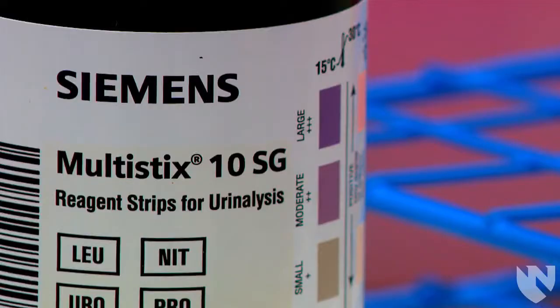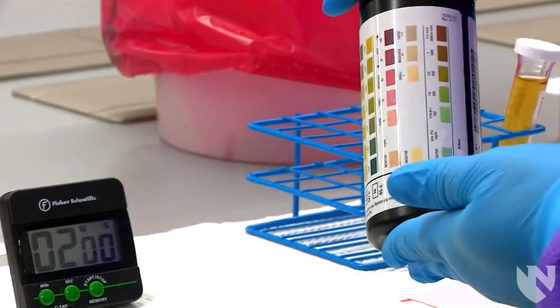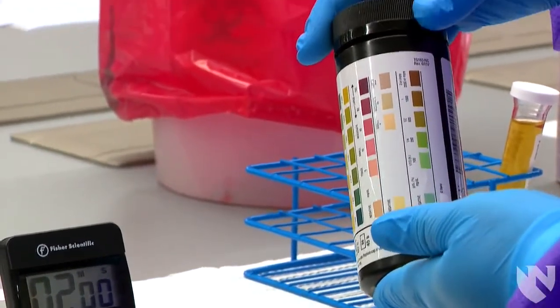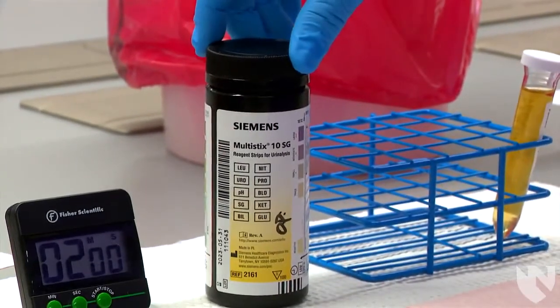In this video, we will be using the multi-stick 10SG reagent strips. The strips are contained in the reagent strip canister, and this allows the strips to remain dry and protected from sunlight, chemicals, or any ultraviolet rays.